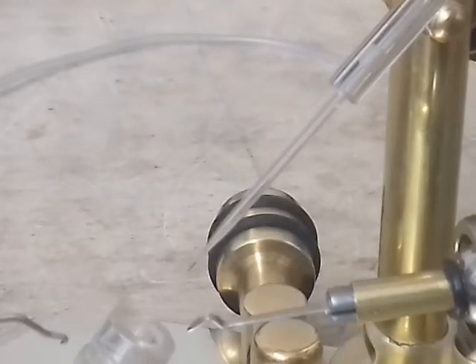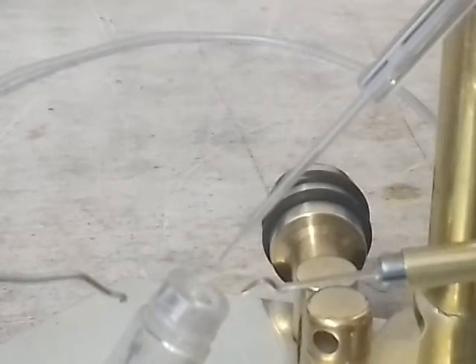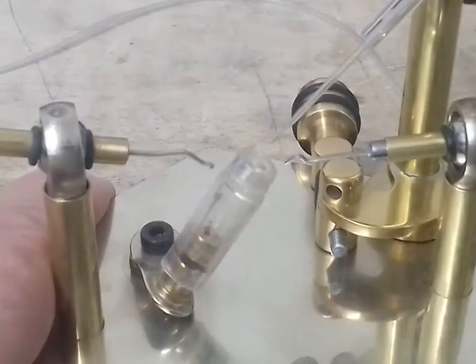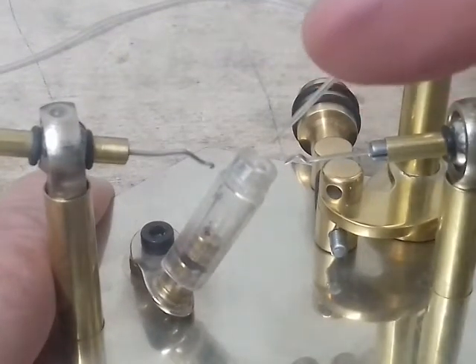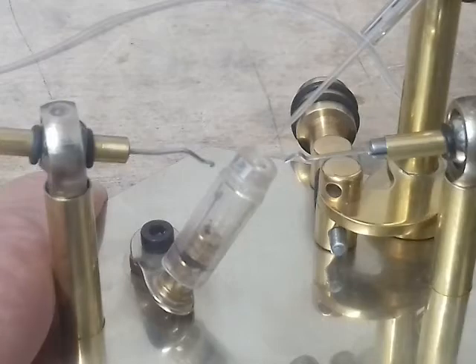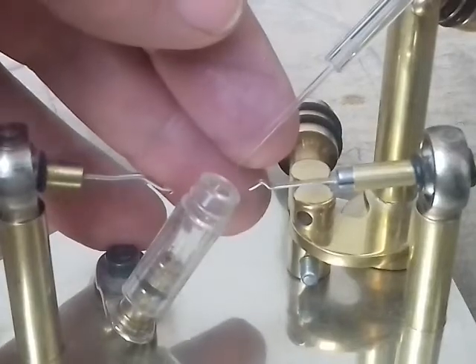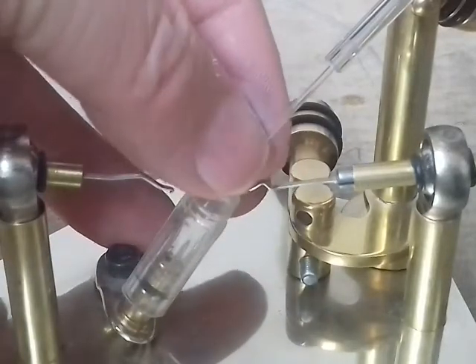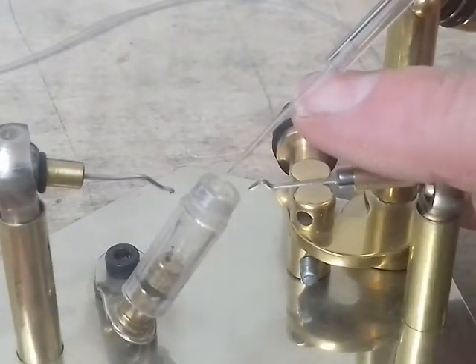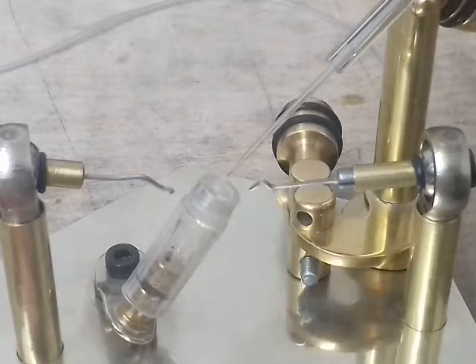So it can give rather than being forced. Once it's in a central position, sometimes I've been practicing on a target, and sometimes when you're not exactly right on the hot spot, the needle will move over and just drop in. It's hard to explain until you actually use it physically. With that needle, if I touch it there, it's able to float slightly, if that makes sense. Sometimes, if it's not quite in the right place, it just drops in the right place, and then you can see the needle move to where it should be.